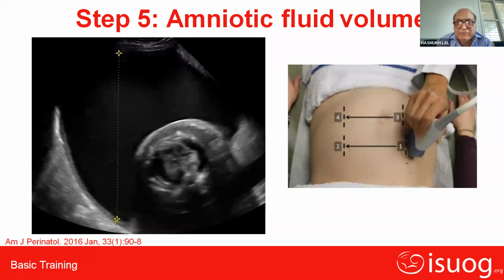The later we do it, the more visualization becomes difficult because of bony ossification, and fetal position. So that attitude of flexion will interfere with visualization.